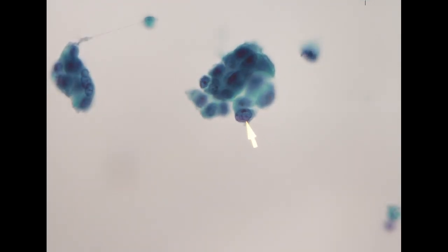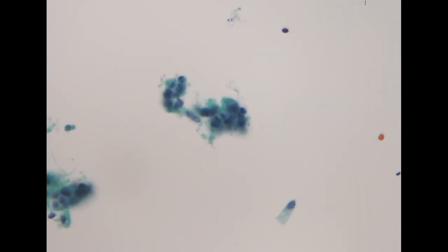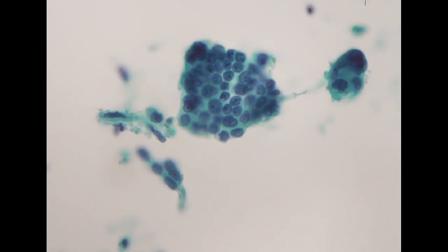The chromatin pattern is vesicular with prominent nucleoli. So this is positive for adenocarcinoma. In the background, we also see some necrotic debris. So this is necrosis that shows in the liquid-based cytology. And the other cells are just like a high-grade adenocarcinoma. So this is positive for adenocarcinoma.